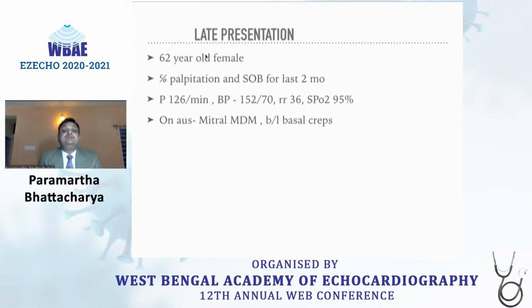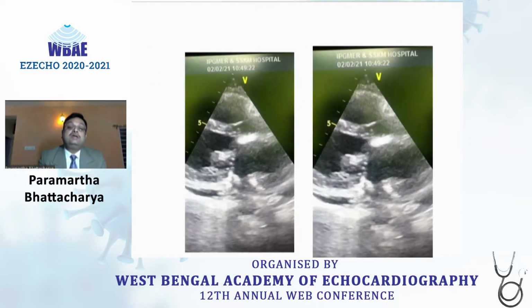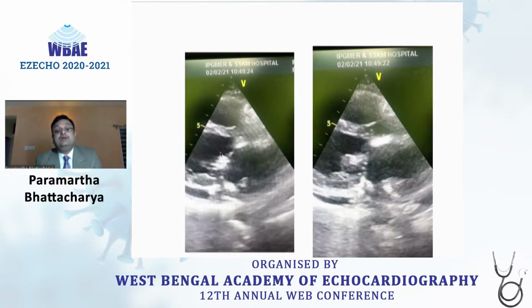Late presentation in a case of a 62-year-old female patient who had palpitation and shortness of breath for the last 2 months. Pulse was 126, blood pressure was almost normal, respiration was a bit hurried, SpO2 was low, and we heard a mitral mid-diastolic murmur and bilateral basal crepts. We thought we were dealing with a case of mitral stenosis, and we wanted to see what the echo showed.